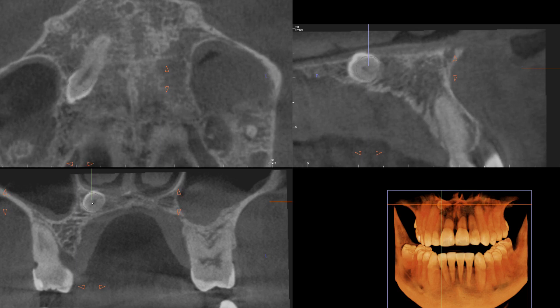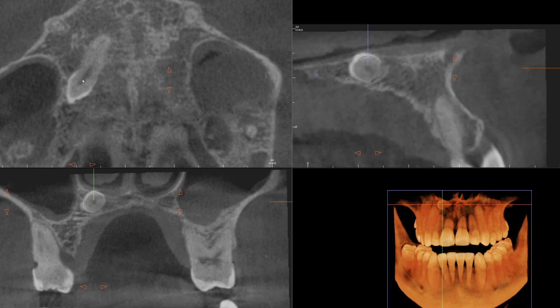The PDL space is not well visualized here either. Whereas if we quickly glance over to the canine region, you can actually follow the PDL space quite well — but that's not the case for this impacted tooth. So what all that tells you is that these features strongly suggest that this tooth is ankylosed, which is probably clinically important to recognize.